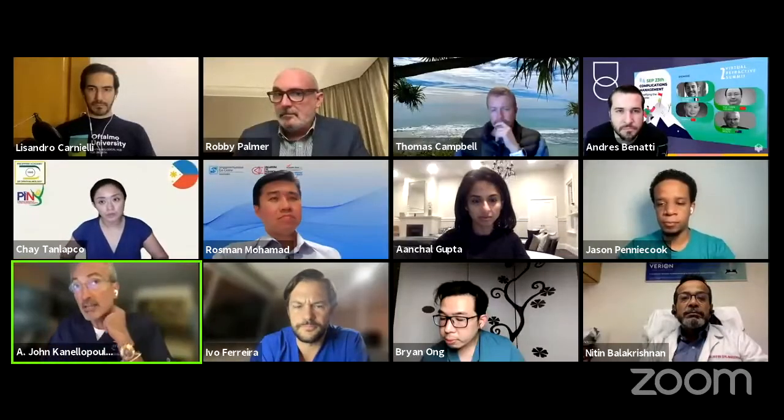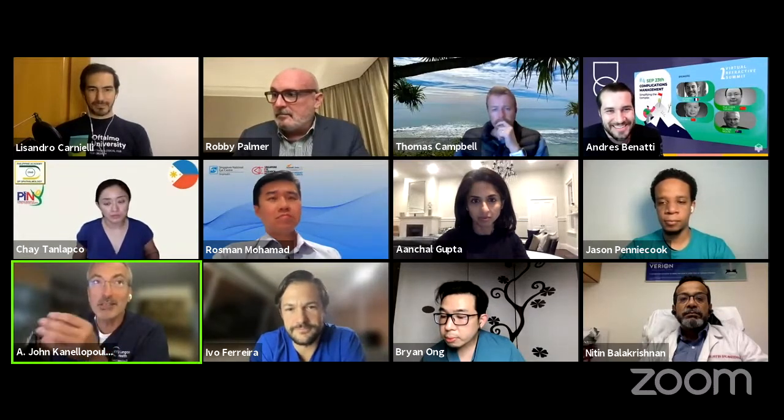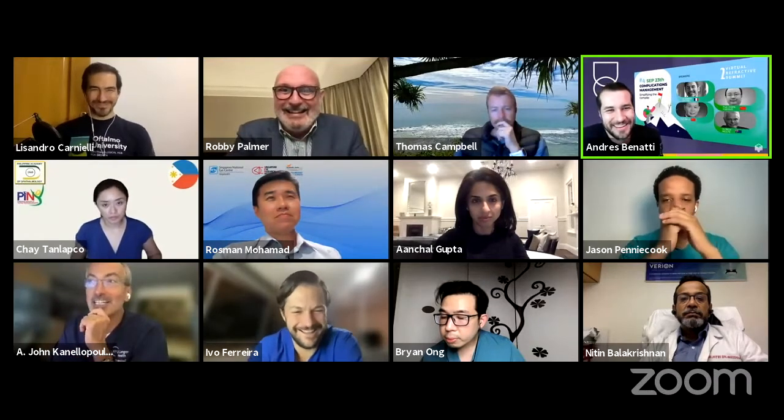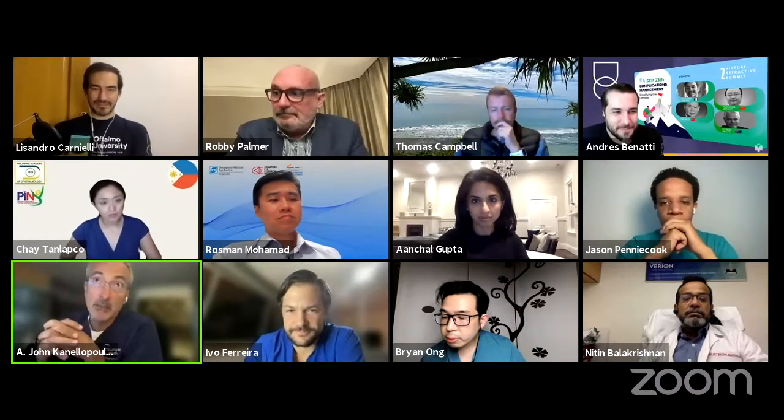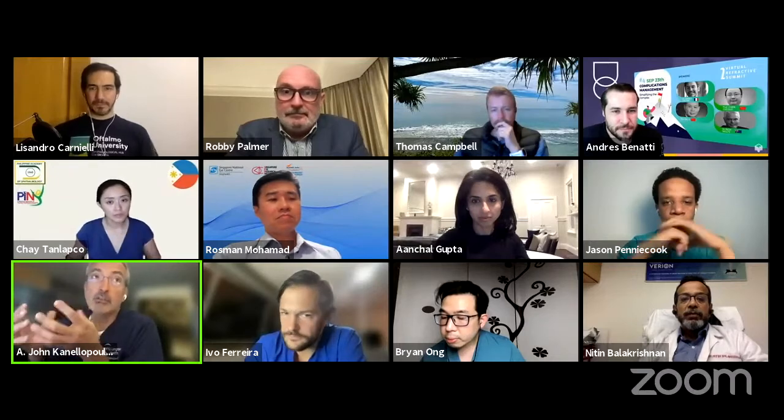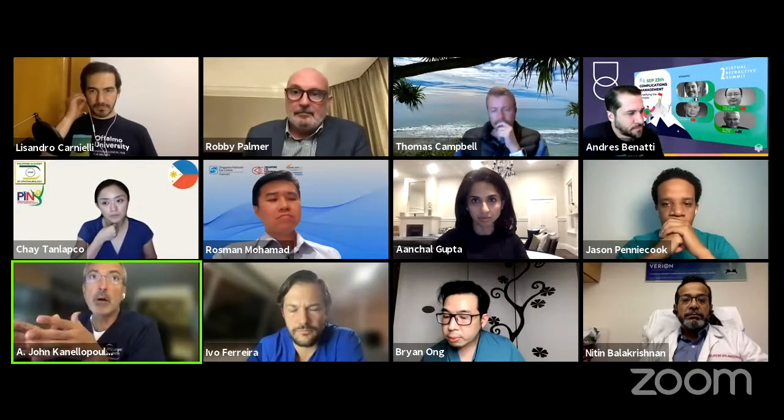It does add time as far as the diagnostics. And thanks for the question. Please call me John, and congrats on your amazing representation with that 360. I'd love to, once we're done with this, sit down with you and you can teach me how to do that. I'd love to use that technology in educating patients. But assessing patients with a Contura platform takes more time. There's no question about it. And this is, in my opinion, the biggest bottleneck in applying it in your practice.